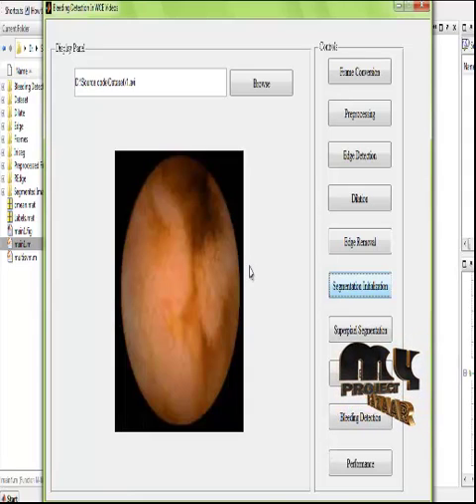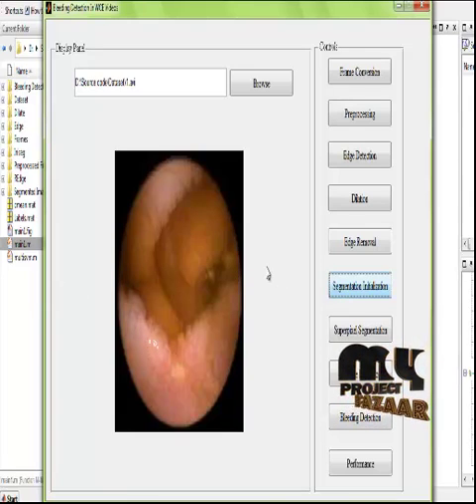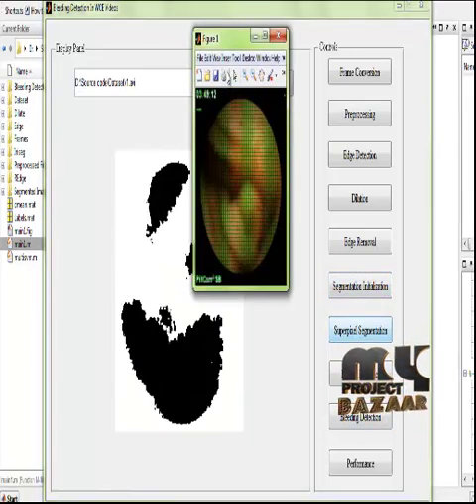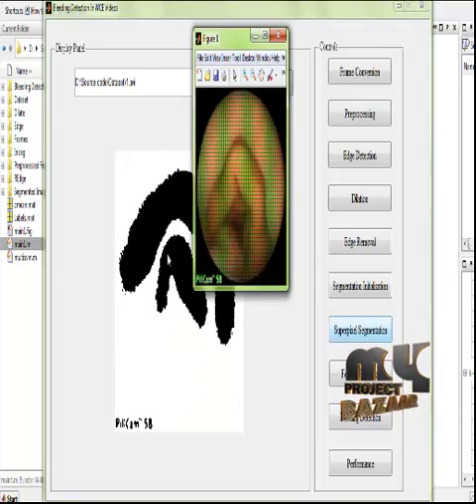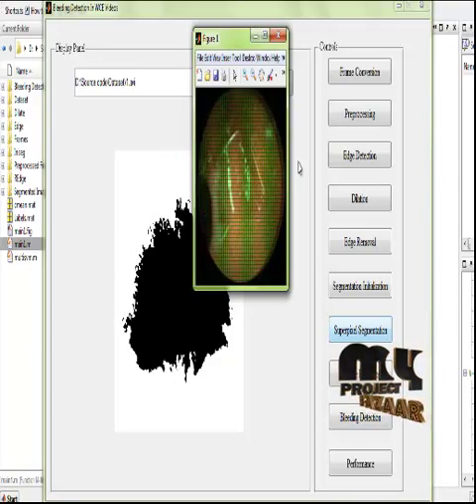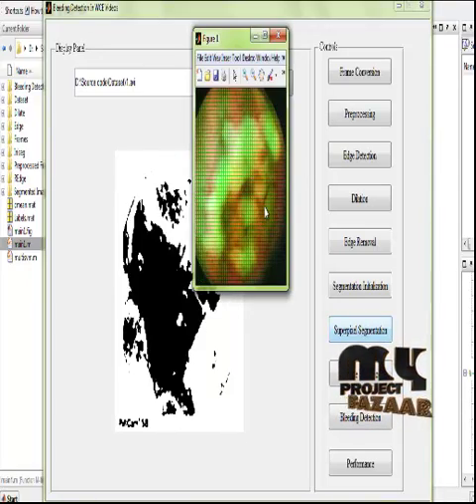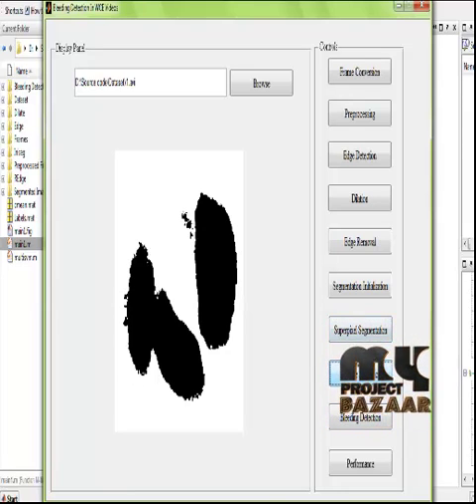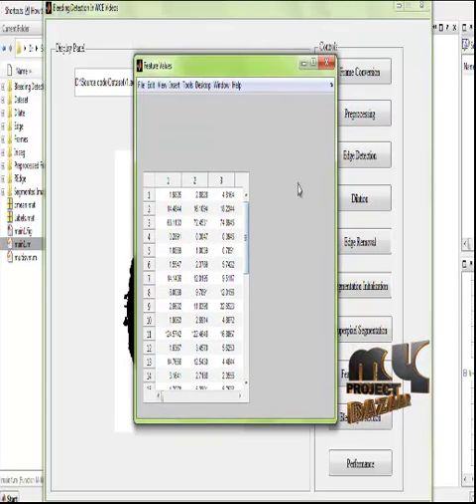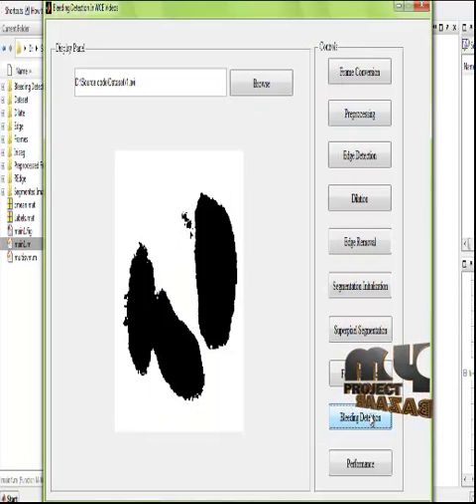This process will take some time for execution. After the completion of the initialization of segmentation, superpixel segmentation is employed. As we can see, the detected regions were obtained here, and the regions were segmented using the superpixel models. The small regions were identified, and based on that, the segmentation is employed. After that, features are extracted from the images, based on statistical parameters extracted from the regions. These statistical parameters are given as input for the bleeding detection process, which is performed using the support vector machine.